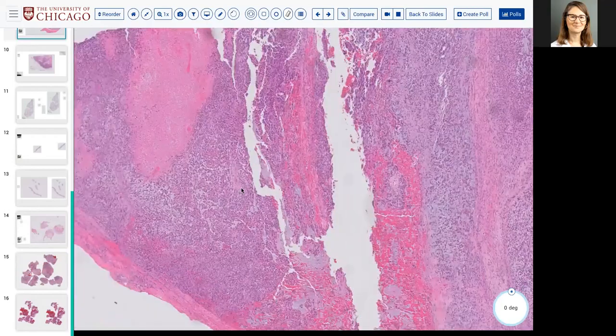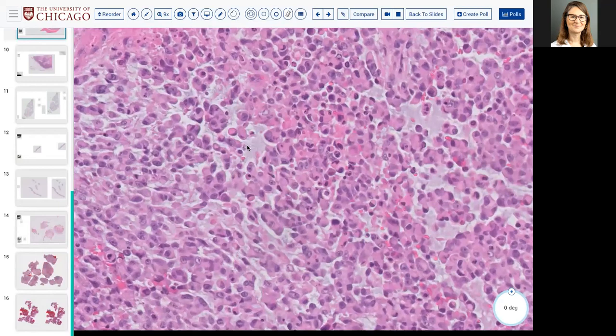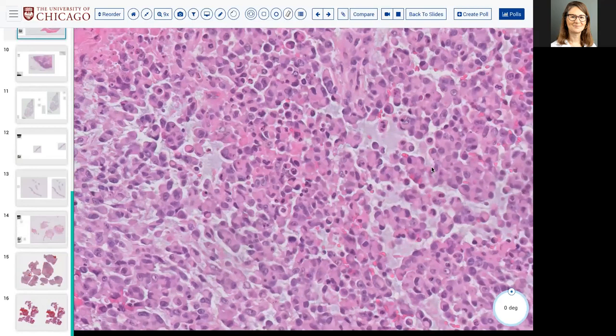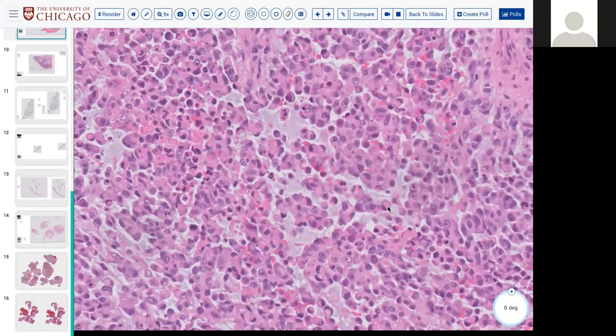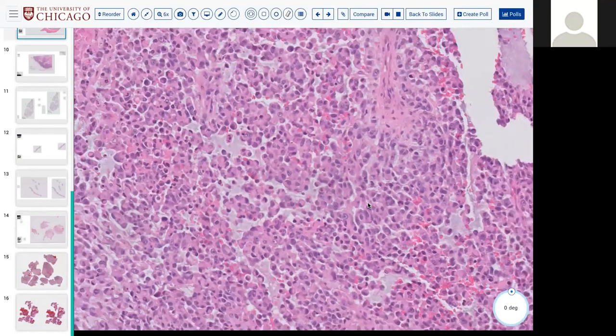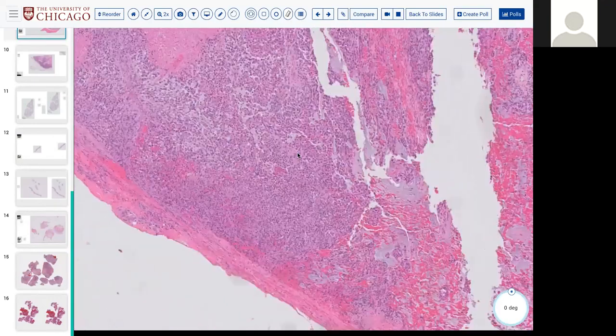Okay, because of the myxoid. And the epithelial cells. Yeah, so there's really pink epithelioid cells that are in nests and cords. Yep. And they have this pink inclusion, and the nuclei are eccentric because of it.